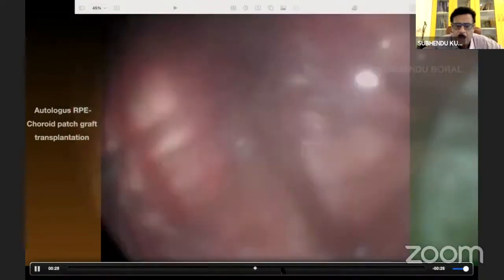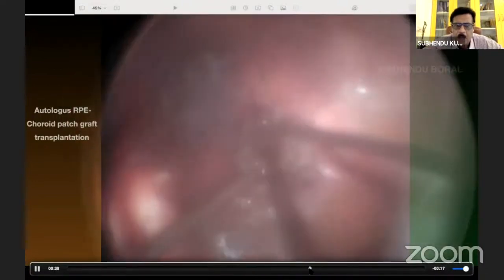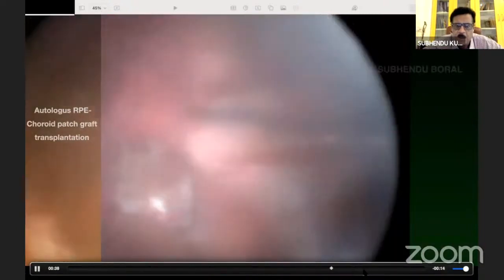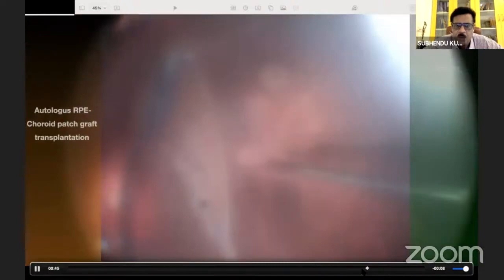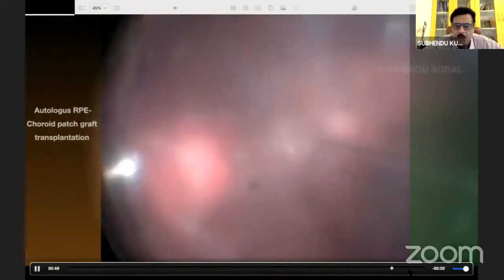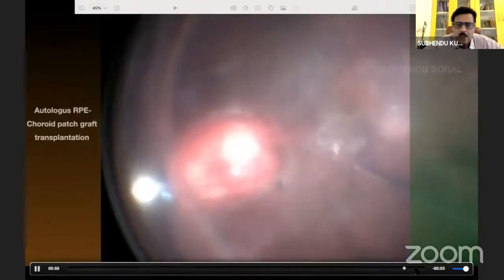area, up to the macular area. Then remove the PFCL, and again inject the PFCL over the disc, starting from the disc, to reappose that retinal flap, and start doing fluid exchange as well as laser. This is another case.